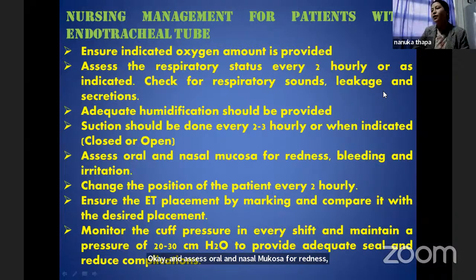Change the position of the patient every 2 hours to facilitate drainage, and also ensure the ET placement by marking and comparing to the previous placement. Monitor the cuff pressure every shift to maintain a pressure of at least 20 to 30 centimeters of water to provide an adequate seal and reduce complications.